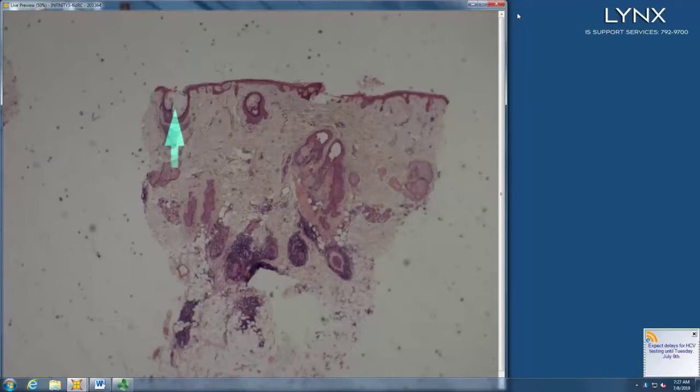In transverse sections, Lila El-Shabrawi referred to that as the Swiss cheese sign as you get up really close to the epidermis. But that's a helpful feature also of alopecia areata, to get that dilatation of the infundibulum, the multiple catagen hairs, and then the infiltrate around the hair bulb.